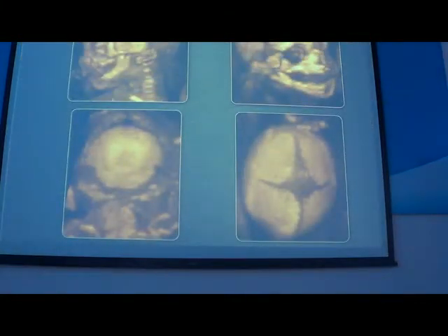So when we study the face, we also have to take care of the skeleton, because behind the face there is a skull, and if there is a malformation of the face, maybe there is a malformation of the skull. And with 3D, it's quite easy to do because you can work with a maximum mode, and with the maximum mode we can see all the skeleton.